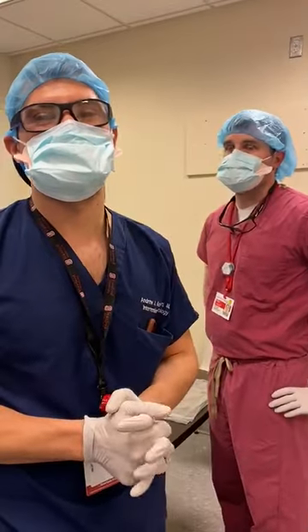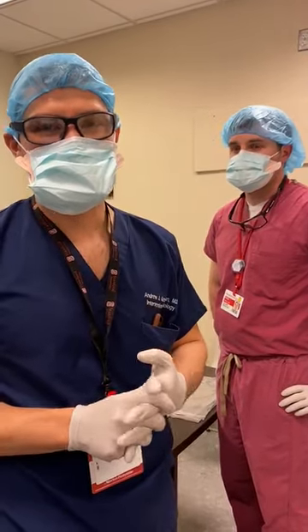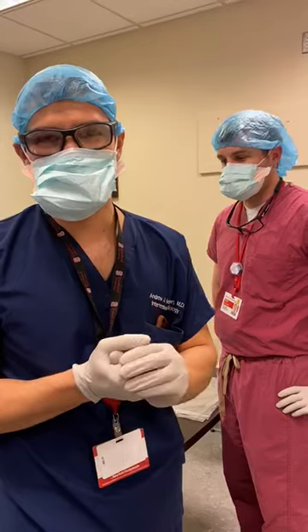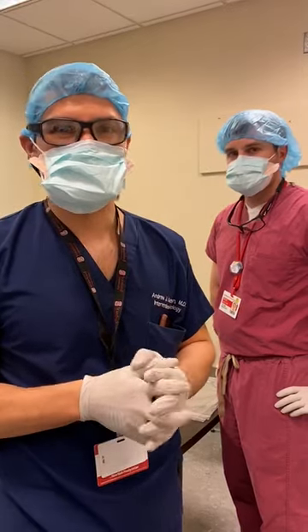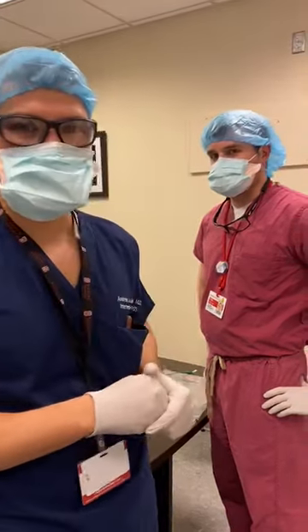Dr. Kesselman from Cornell Interventional Radiology. Here today we're using the Mentis unit to demonstrate pelvic embolization for trauma. This is our fellow, Dr. Smith.